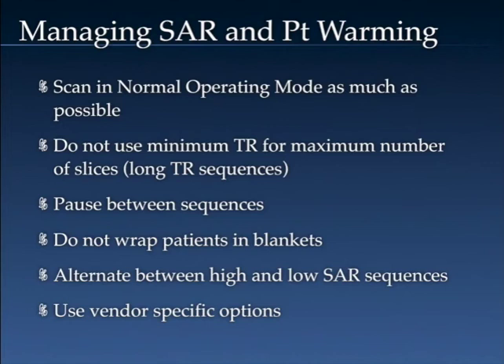Also, don't wrap the patients in blankets, certainly not heated blankets. Remember, you're putting RF energy into the patient, and they're going to need to cool to release that energy. And if you have them wrapped in a blanket, then they're not going to be able to cool. Along the same lines, make sure you have plenty of air moving through the bore. Most cylindrical bore magnets have a bore fan to move air through the magnet. Make sure that is happening, because this is a way that patients can cool.